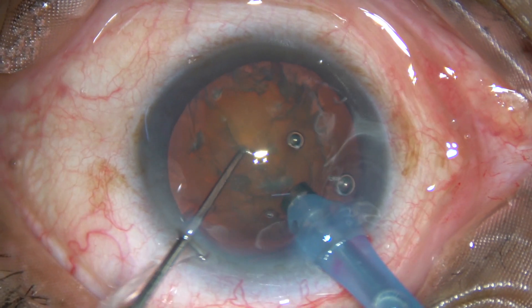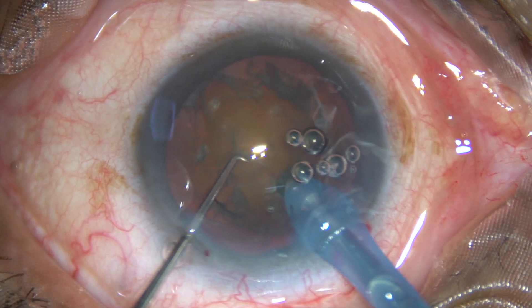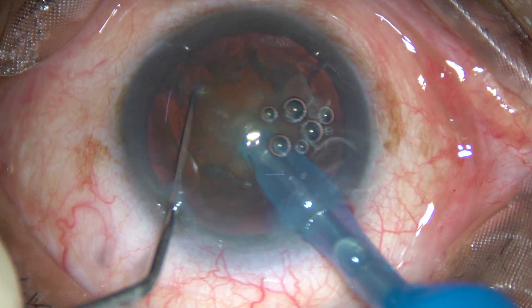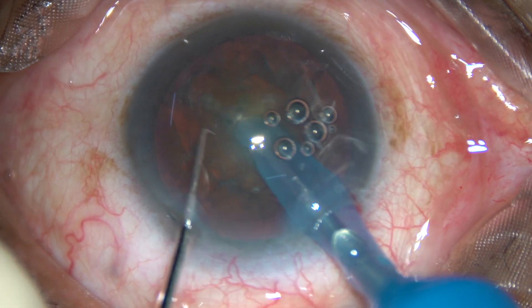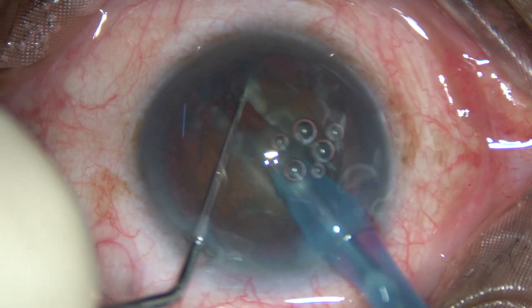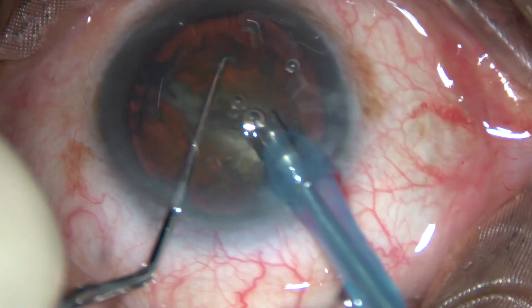This is submarine chop. The tip goes into the substance of the nucleus, travels through the nucleus, crosses the center, and then you chop it like this. See how beautifully you can chop it.